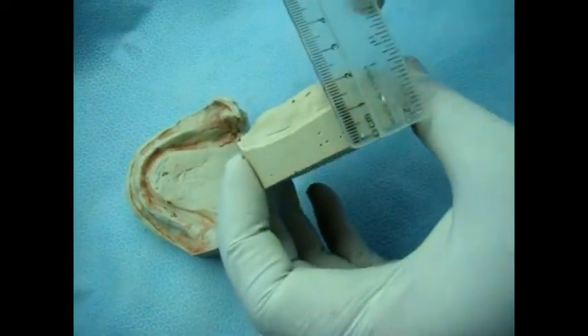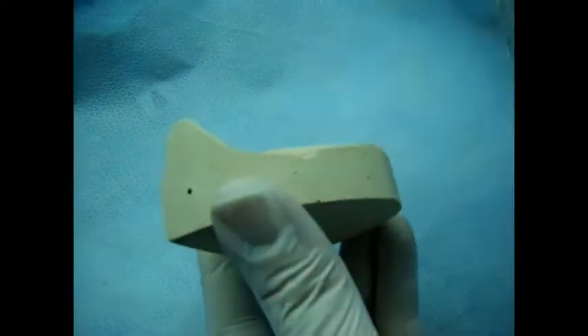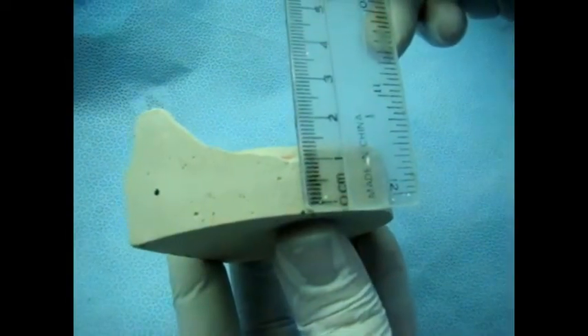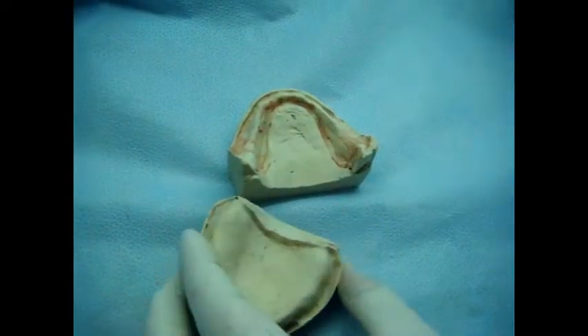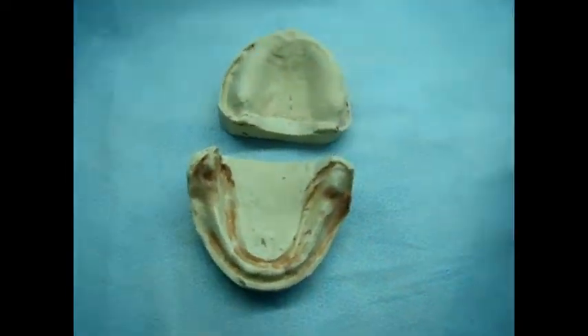These are the finished casts. The sides of the cast are vertical. The base thickness should be at least 15 millimeters, and 10 millimeters in the thinnest area. The tongue space on the lower cast must be flat, sides must be vertical, and the least thickness of the base is 10 millimeters. The sulcus is preserved and the surface of the cast is free of voids or bubbles, representing the anatomy of the impression.